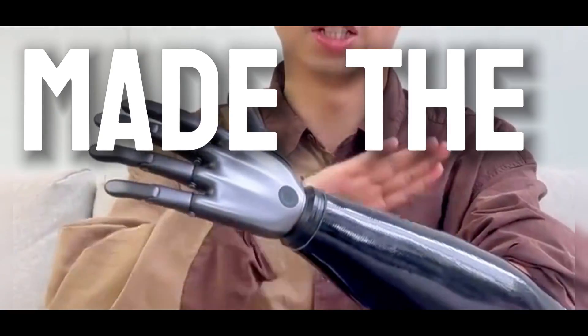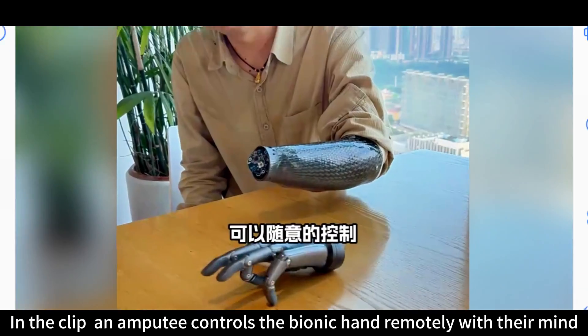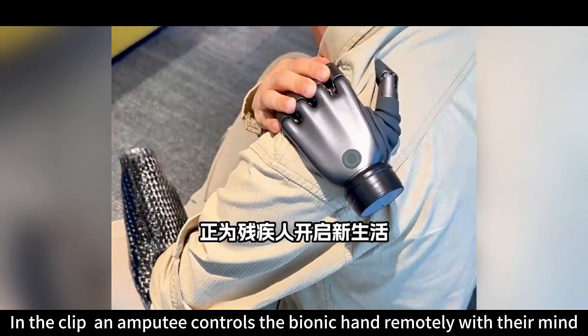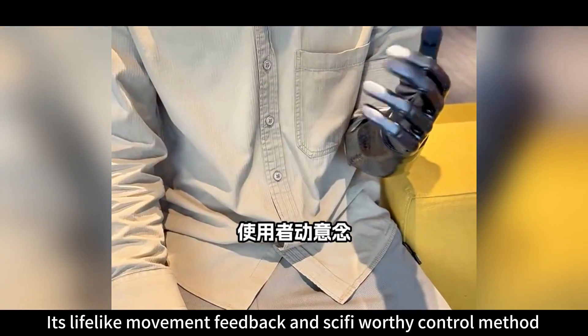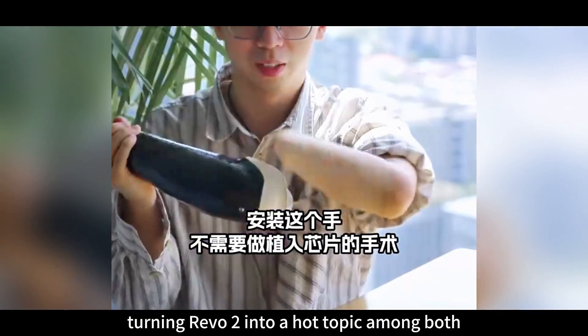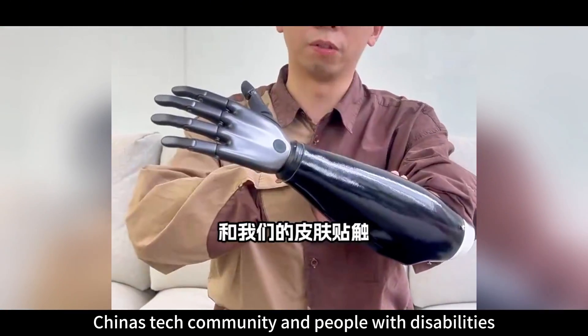A 15-second short video made the Revo 2 bionic hand a viral sensation on social media. In the clip, an amputee controls the bionic hand remotely with their mind. Its lifelike movement, feedback, and sci-fi-worthy control method quickly went viral, turning Revo 2 into a hot topic among both China's tech community and people with disabilities.